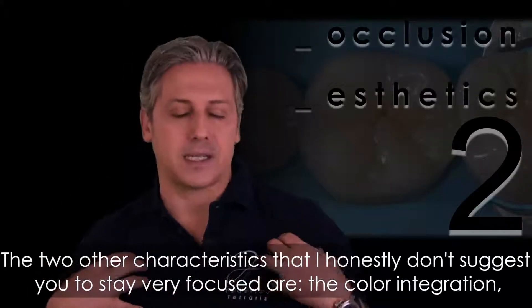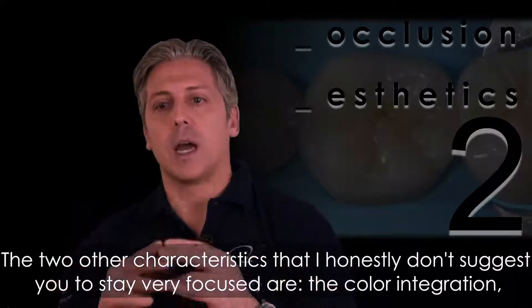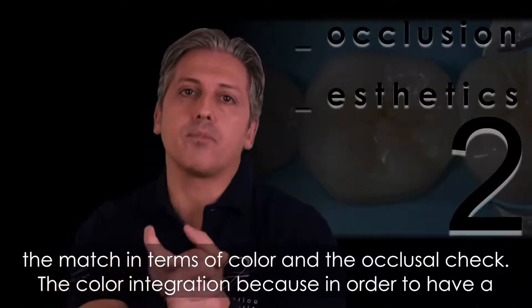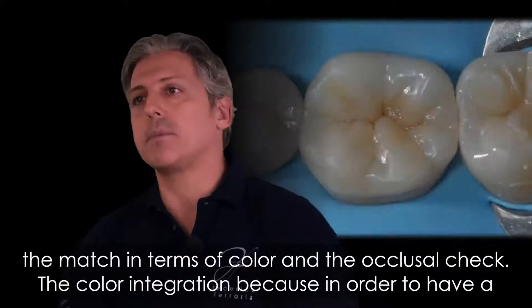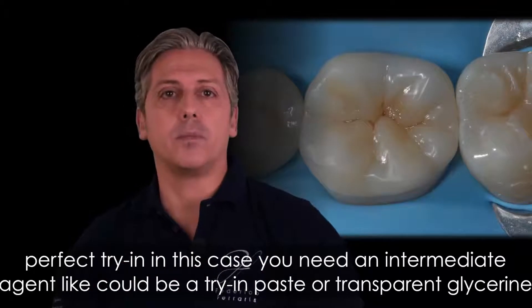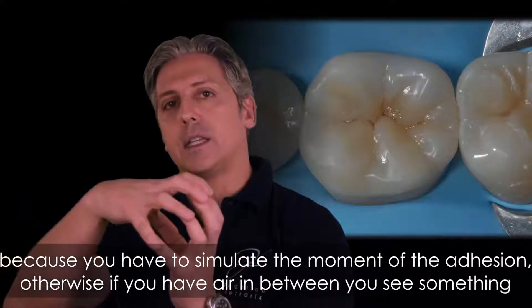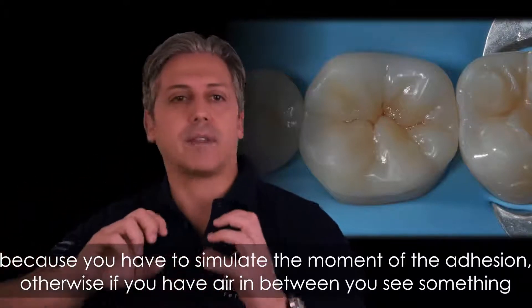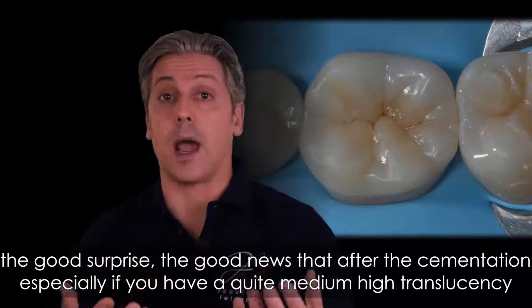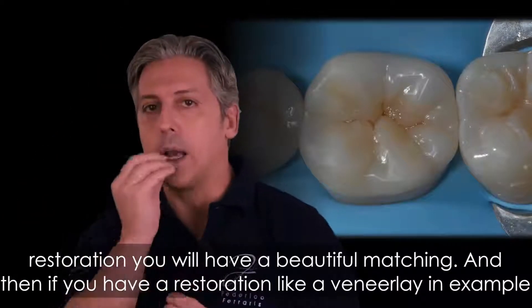The two other characteristics — color integration and occlusal check — are ones I honestly don't suggest you focus on intensely. For color integration, in order to have a proper try-in evaluation you need an intermediate agent, like a try-in paste or transparent glycerin, to simulate the moment of adhesion. Otherwise, with air in between, you see something different in terms of color — it could be higher value or not perfectly integrated. But you can have the good surprise that after cementation, especially with a medium-to-high translucency restoration, you will have a beautiful color match.